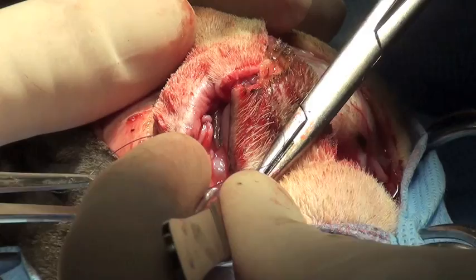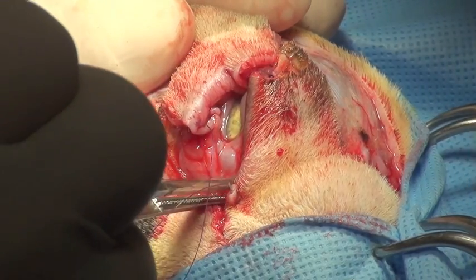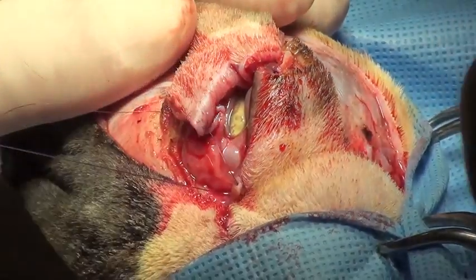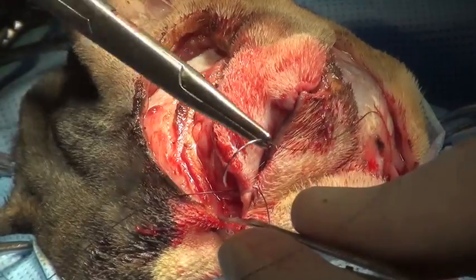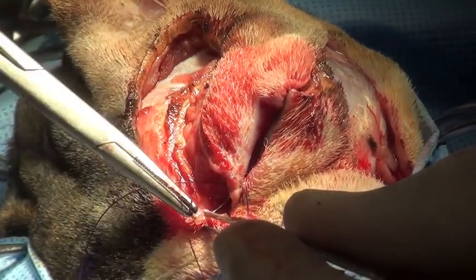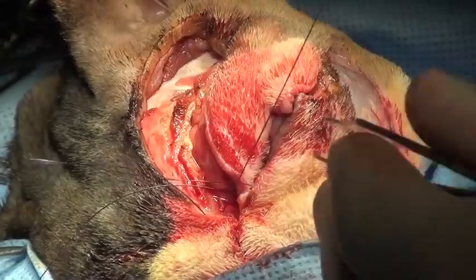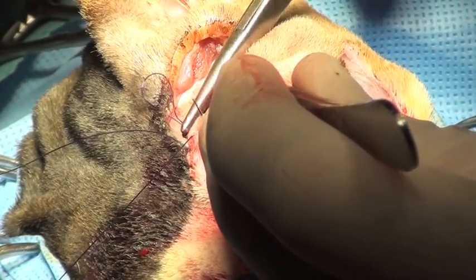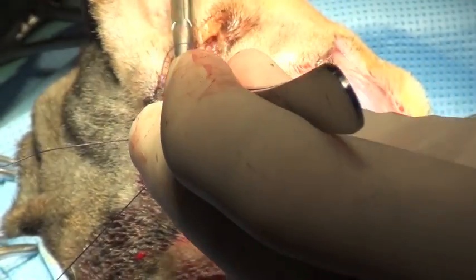The cranial border of the lip flap is sutured to the medial canthus of the eye. The skin is closed using a meticulous intradermal suture pattern.